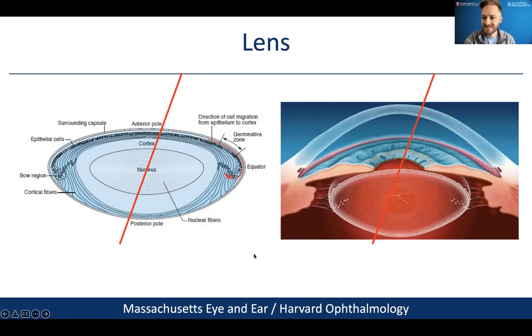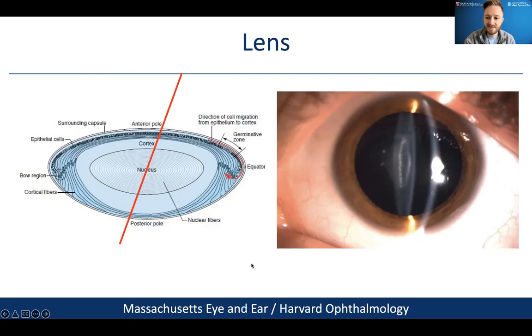So what does this look like? What does this look like when we're evaluating the eye? Well, first, we see that the light is hitting the cornea. So this is the corneal reflex. It's out of focus because we're not focused there. We're focused behind it by pushing the slit lamp forward towards the lens. But I've highlighted it here so you see what we're talking about. Next, we see that it goes through the fluid and it hits the iris up here and down here.